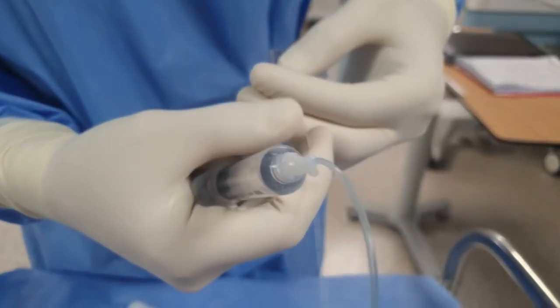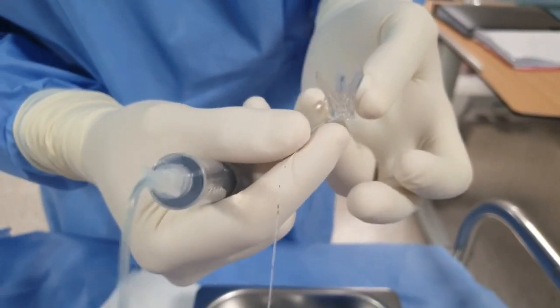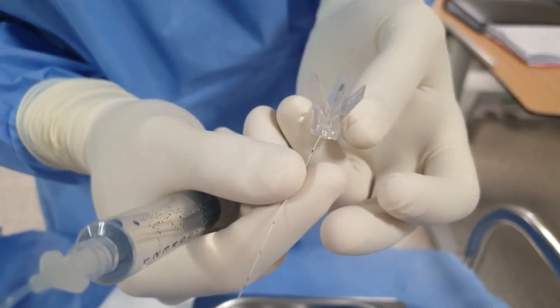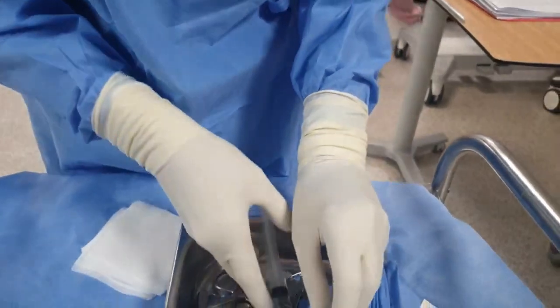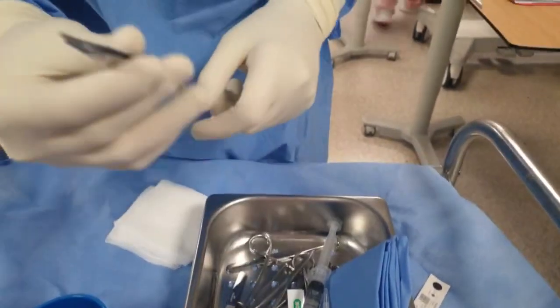A trick to know that you are in a good vein: the catheter will pass 5 cm. If it stops at 4 cm, that means you are not in the vein. So passing 5 cm is the sign that you are in a vein. From the instruments, we are going to use the iris only.